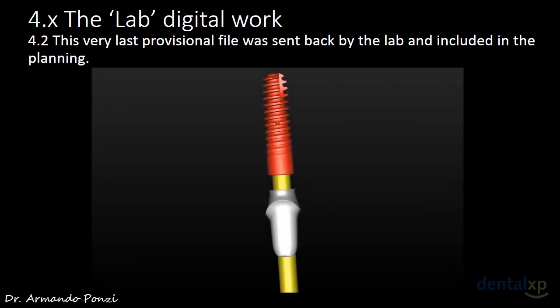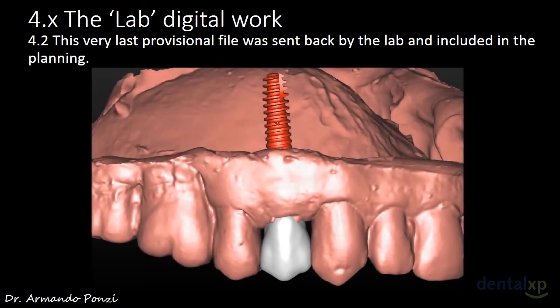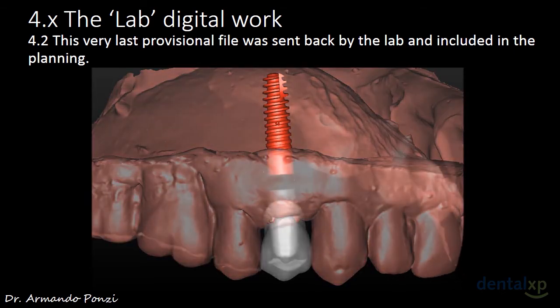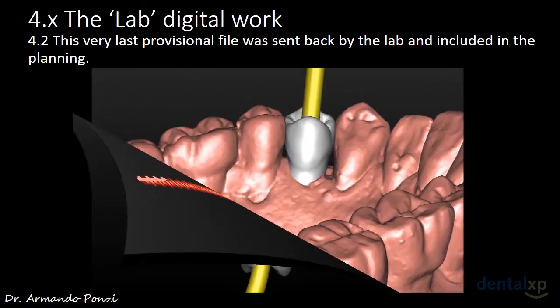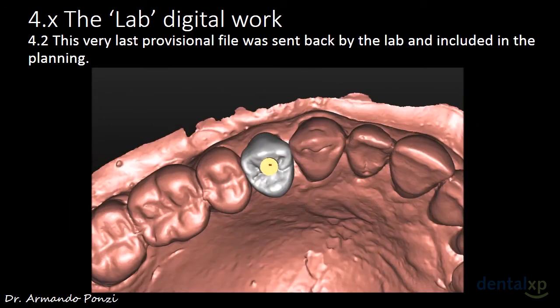This very last provisional file was sent back by the lab and included in the planning, as we see here. And in particular, we see the implant, the abutment, and provisional in different angulation and within the impression.